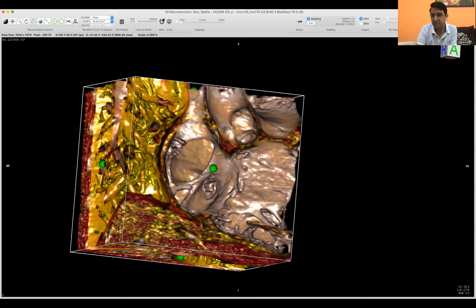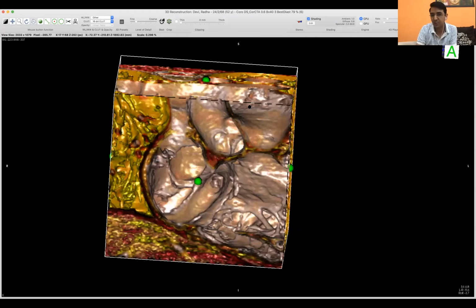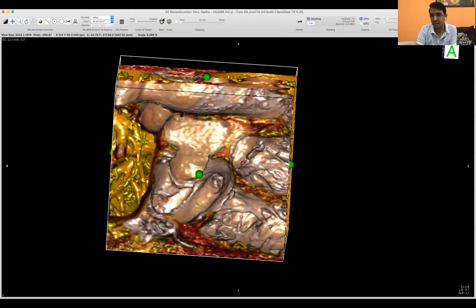And this is how we can see rims. Now, this is the IVC, and I was mentioning some time back, the IVC lies slightly posterior and off axis to the SVC, and they are not in the same plane. That is important because this actually helps in moving our TE probe when we are actually doing the TE. Now, you see, this is the place of IVC, while this is the plane of SVC. They are not in the same angle.